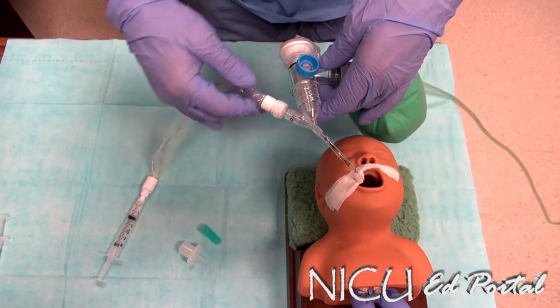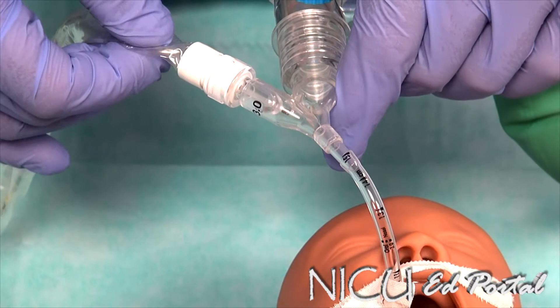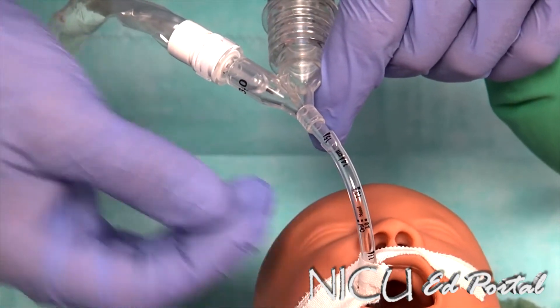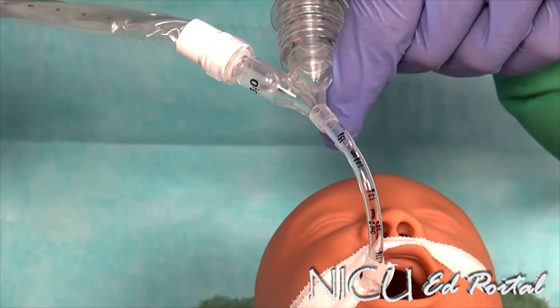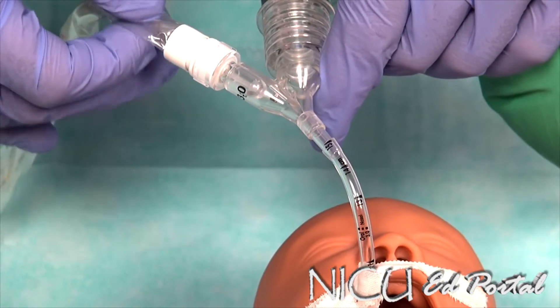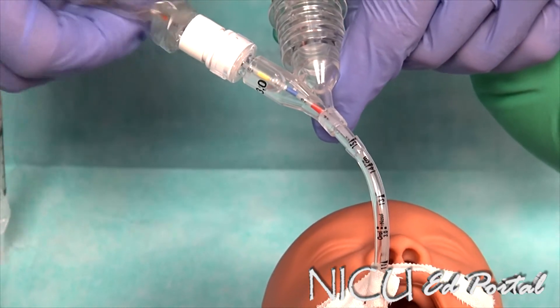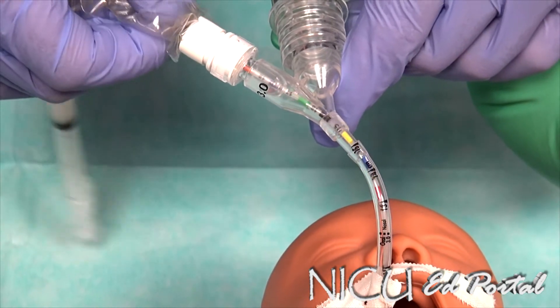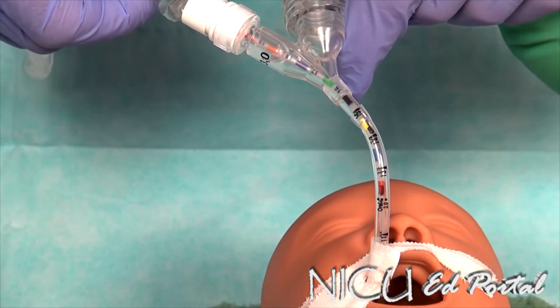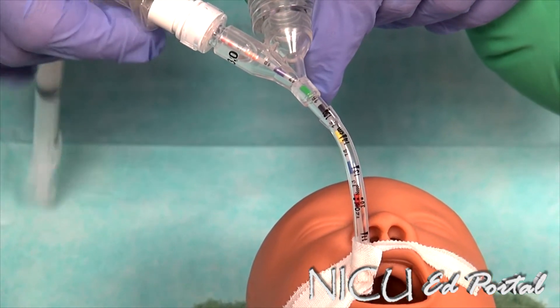We take the catheter, stabilizing the ET tube, and insert the catheter, matching up the markings on the endotracheal tube to the proper markings on the catheter. I will be matching up the 14 on the endotracheal tube to the 14 on the catheter, which tells me I am at the end of the endotracheal tube. I insert this down the endotracheal tube until the markings match up at 14 to 14, then advance about a half centimeter beyond that, ensuring I am just past the endotracheal tube prior to administering the surfactant.